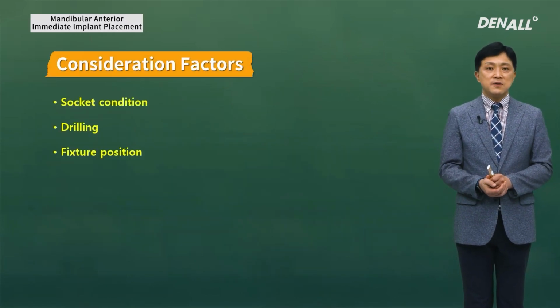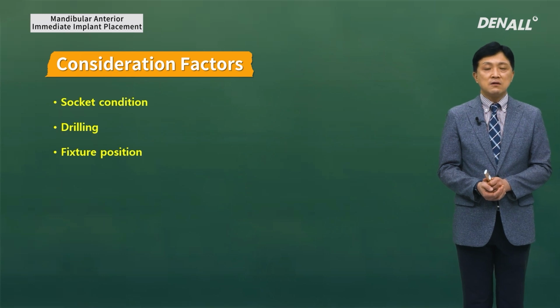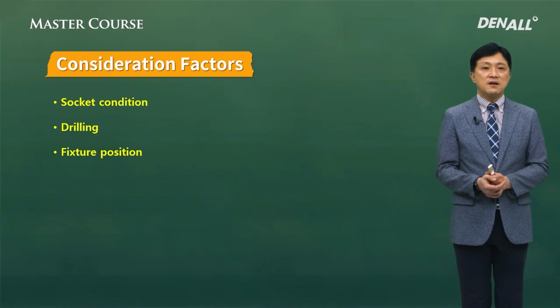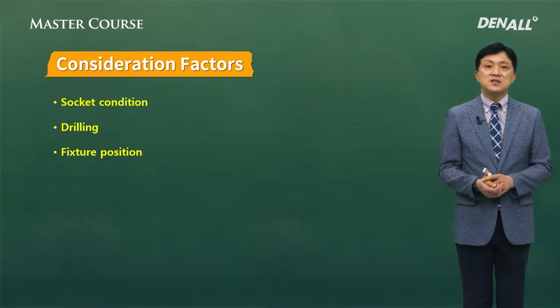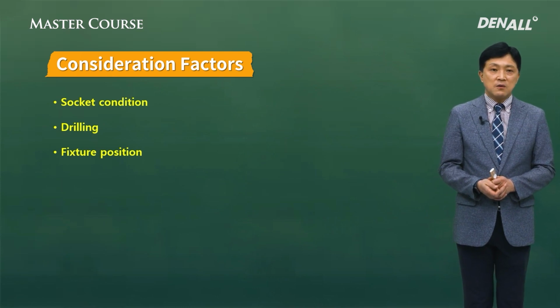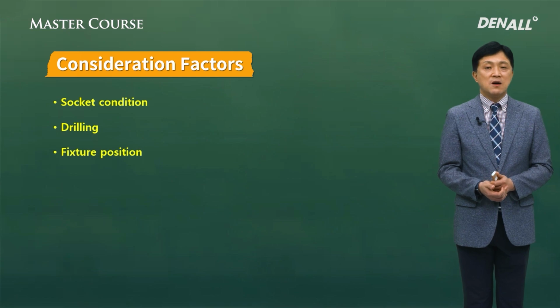So there are factors we need to consider for the lower anterior region. First, socket condition. Second, drilling. Third, implant position.